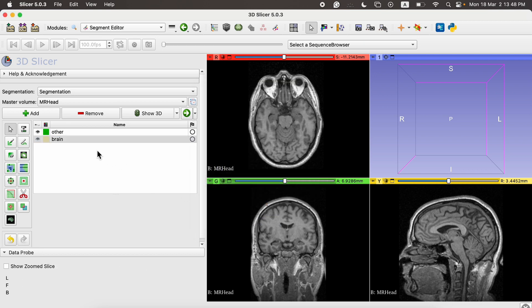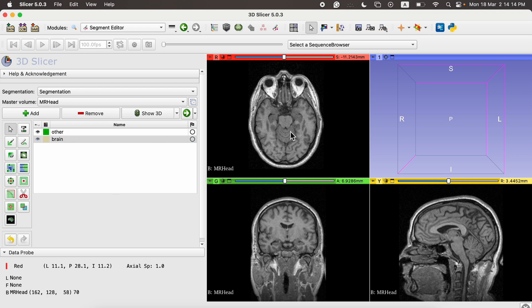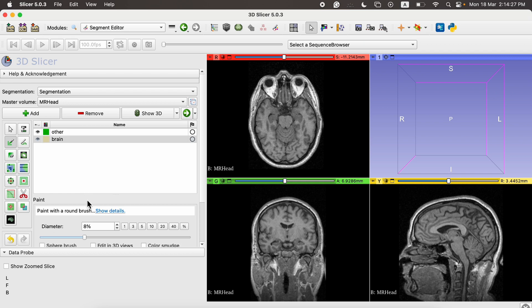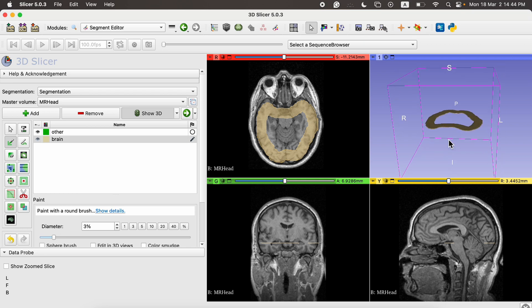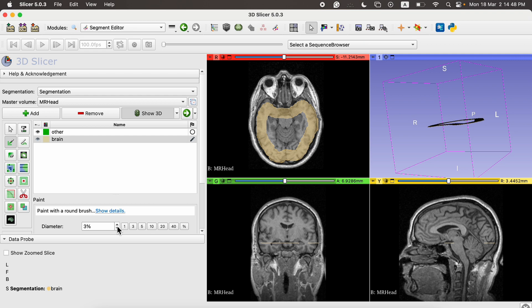To start, the first option is manual segmentation. We have three tools: the paint tool, the draw tool, and the eraser to fix mistakes. This is very handy when segmenting tumor regions where you might have two or three lesions to delineate accurately. In the paint tool, the diameter is initially set to three percent. Clicking the Show 3D button lets us visualize what we are doing in 3D form.